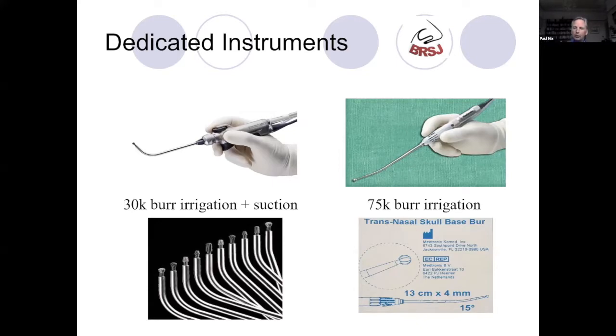The Midas Rex drill with a skull base attachment is a very nice long thin drill with irrigation but no suction, and it runs at a much higher speed.